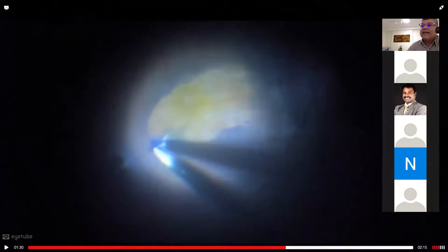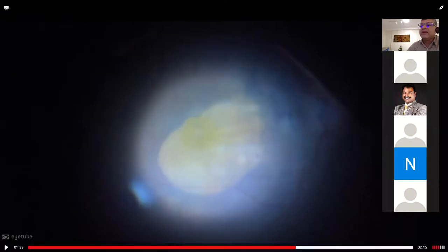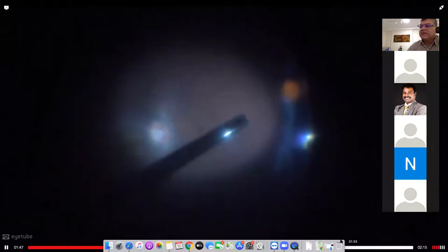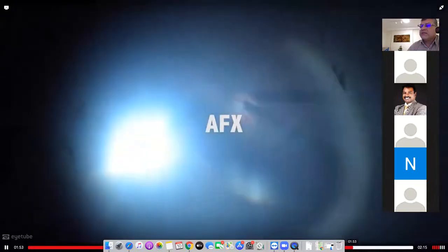You can always get the ILM back in case you miss it — where the edges are lifted. If you have a good wide-angle view and macular view, it's easy to get it and go either clockwise or counterclockwise. I'm extending the peel further to avoid any scaffolding. Now I completed the peel. I like to do some endolaser for retinal protection — not many people do this, but I like it just in case.